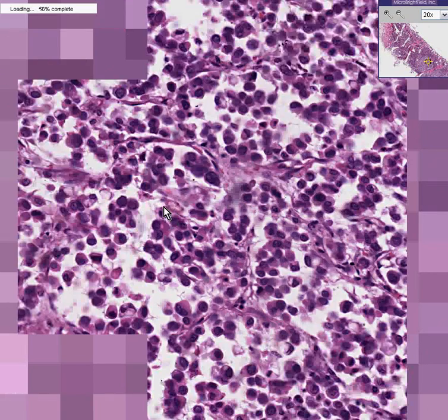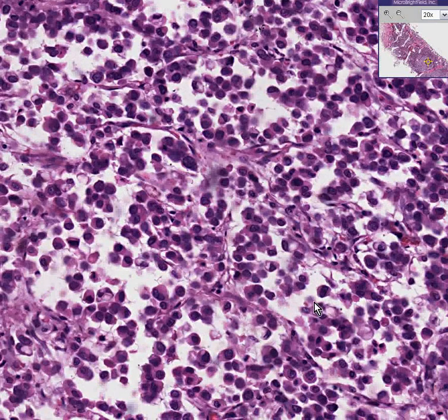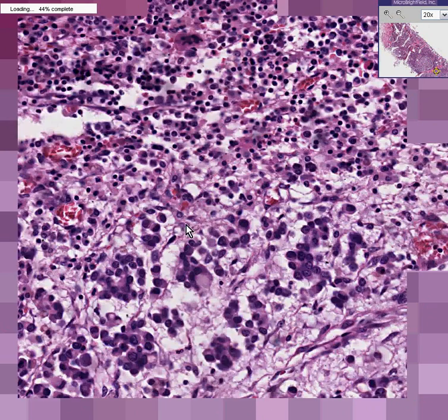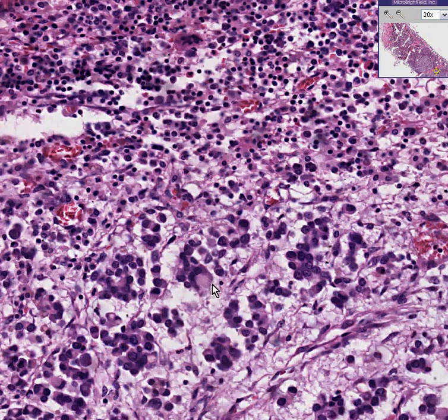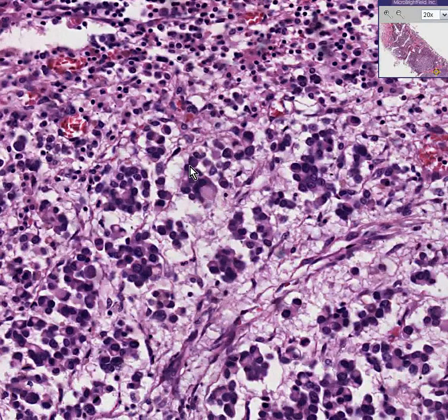Let's take another random area. In some of the areas, it looks like there may be vacuoles inside of some of these cells. Let's go to another random area. Here's an area that looks like there may be some sort of vacuole. And in addition, you'll see structures like this, which if you have even not a good imagination, you could say it looks like these cells are trying to form little glands.